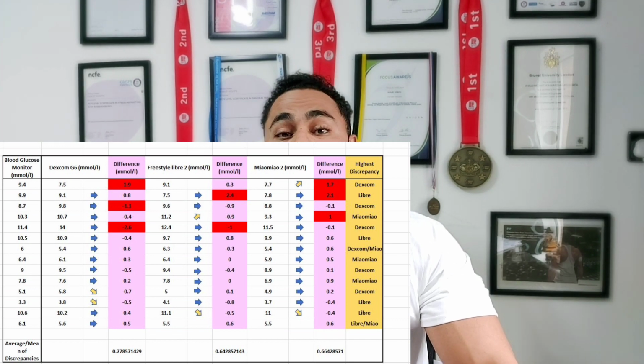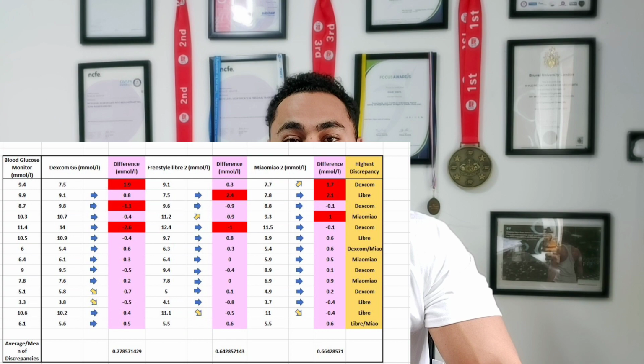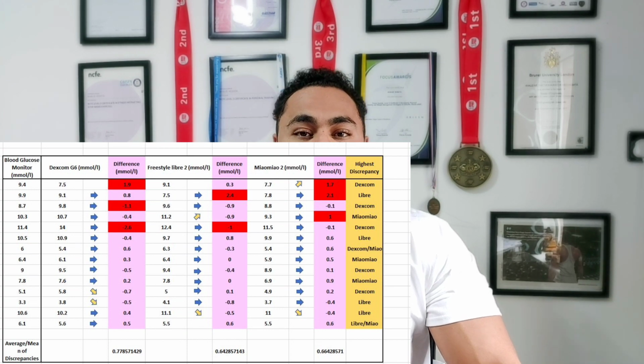So which one is more accurate then? That's the thing, they're all different. So they're all different in terms of speed. Okay, how long would it take me to measure the blood glucose from the interstitial fluid to be able to match it with the blood glucose monitor? All right, where is it installed? Okay, is it installed in my arm? Is it installed in my core? Is there enough fat? How is the blood flow in this area? There's a lot of factors, right, that could affect that.